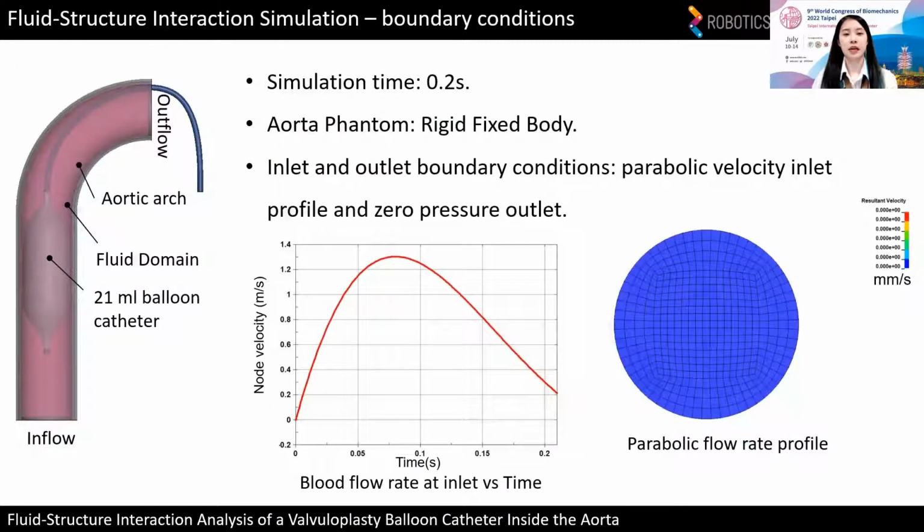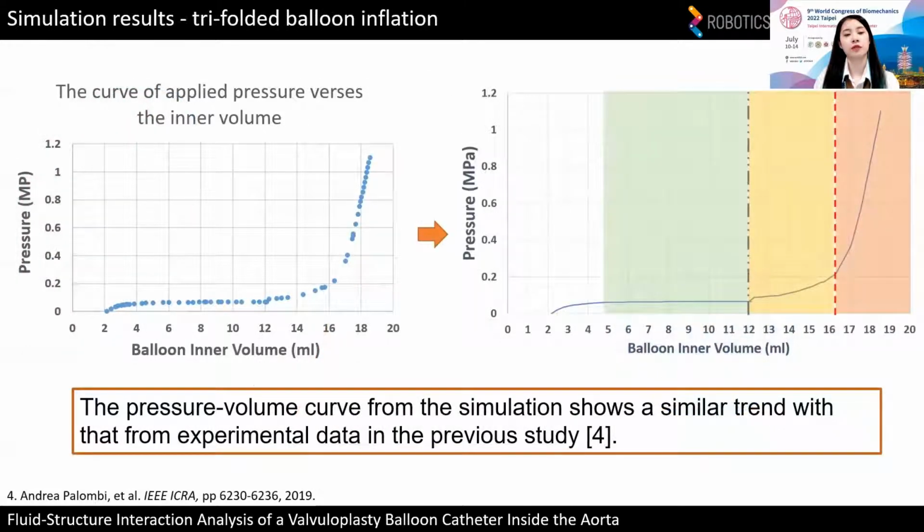When it came to the FSI simulation, the balloon with a bended catheter model was inserted inside an aorta with an arch. The catheter was touching the upper inner wall of the aorta. The simulation time is about 0.2 seconds, which is an average time of the systolic duration. The aorta is simplified as a rigid fixed body. The inlet boundary was applied as a parabolic velocity profile as shown in the video, and the velocity change with time is shown in the plot. For the outlet section, zero pressure was applied. Here is the result of the simulation.